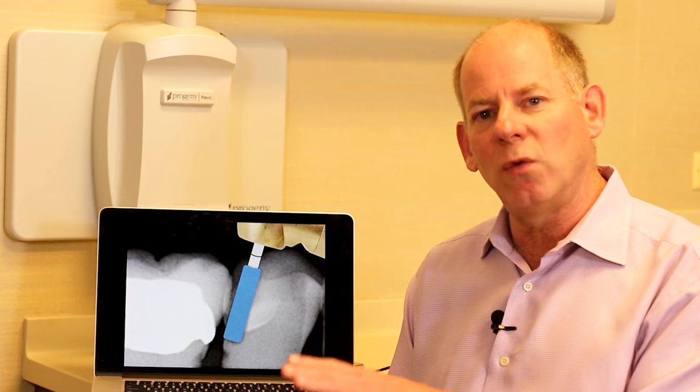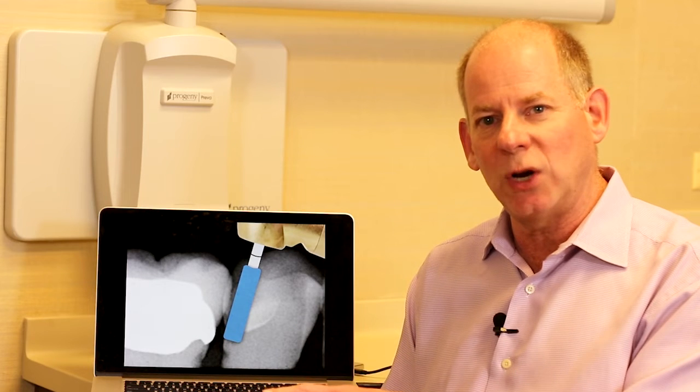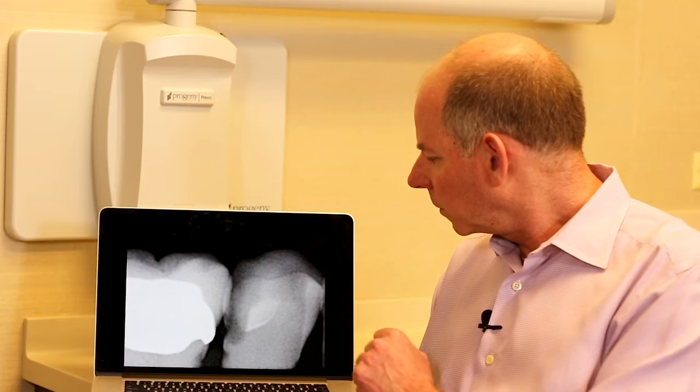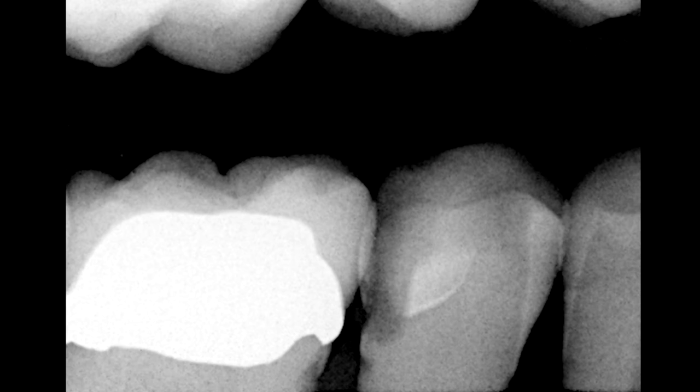I'm going to start by removing part of the old existing restoration to get to the point where I can find the new caries. As I'm drilling, it's very difficult to see down in that area. I thought I had gotten to the caries, took a radiograph to verify, and you can see my drilling stopped but I'm still not at the point of the caries yet. If you're not certain, stop and get an interprocedure radiograph to verify you're actually at that point — these are really difficult to find.